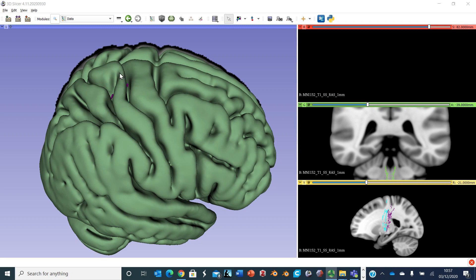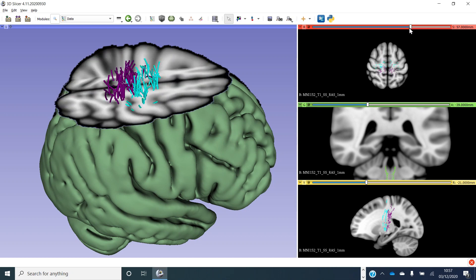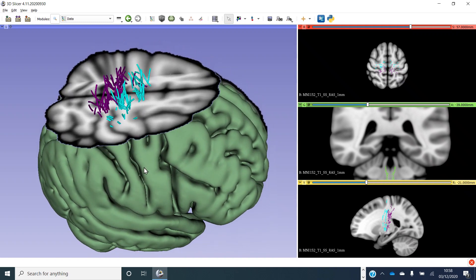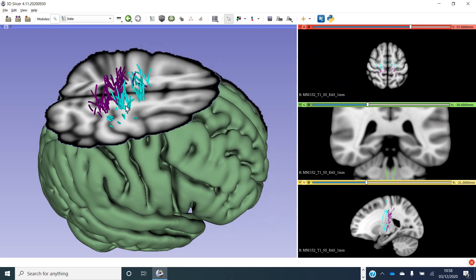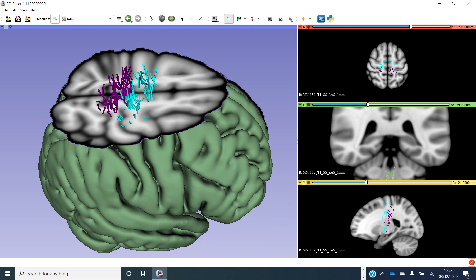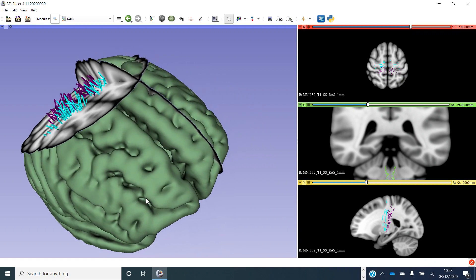What we're going to do is just slice down through this brain a little bit. We can see that the fibres associated with the pre-central gyrus are shown here in light blue, and those associated with the post-central gyrus in purple. The blue fibres are upper motor neurons — fibres of the corticospinal tract originating in the motor cortex and descending down. The purple fibres are third-order sensory fibres coming from the thalamus and ascending up to the primary sensory cortex. In the anterior view, we can see they're going to the medial cortex, correlating to the lower limb.